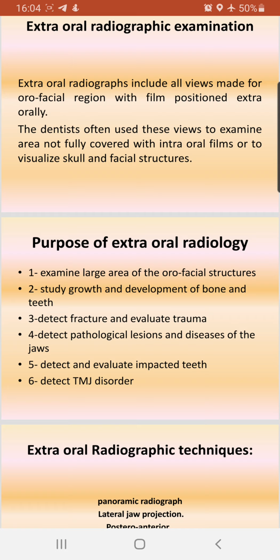Number 1. To examine large areas of the orofacial structure, study growth and development of bone and teeth, detect fracture and evaluate trauma, detect pathological lesions and diseases of the jaw, detect and evaluate impacted teeth, and detect TMJ disorder.